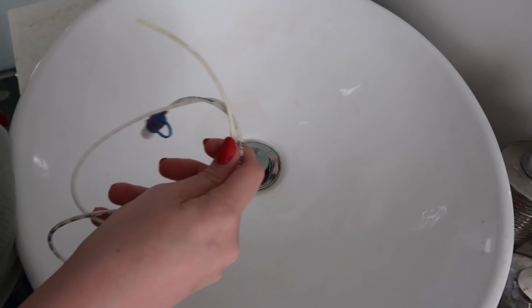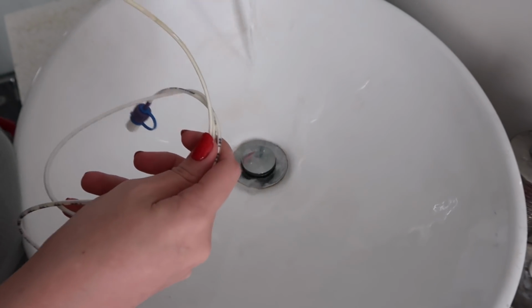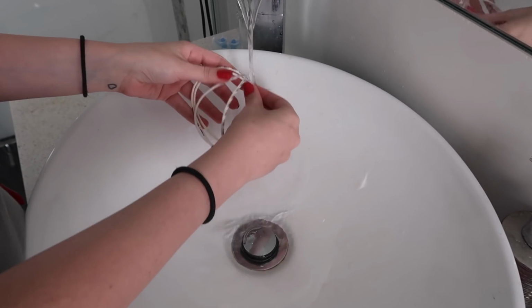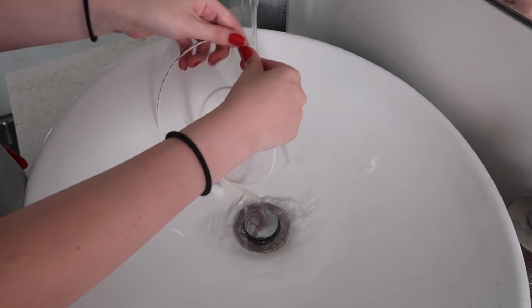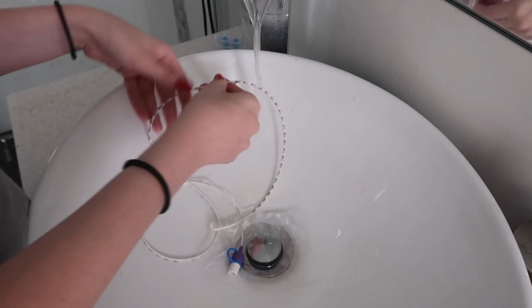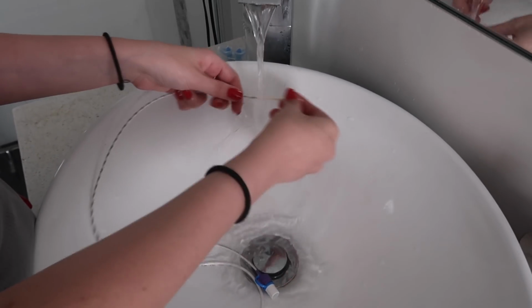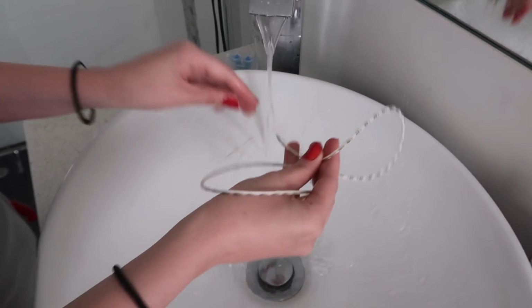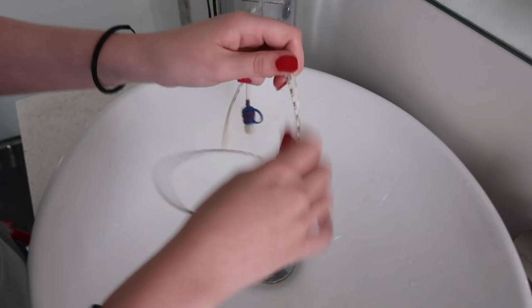Okay guys, so you want to get quite warm water, but not too much that it's burning you, but you can see the steam off it, and you just kind of run it through your hands, because warm water is going to be the closest to get all the gunk off from the outside. And that's pretty much all you want to do, just like that.